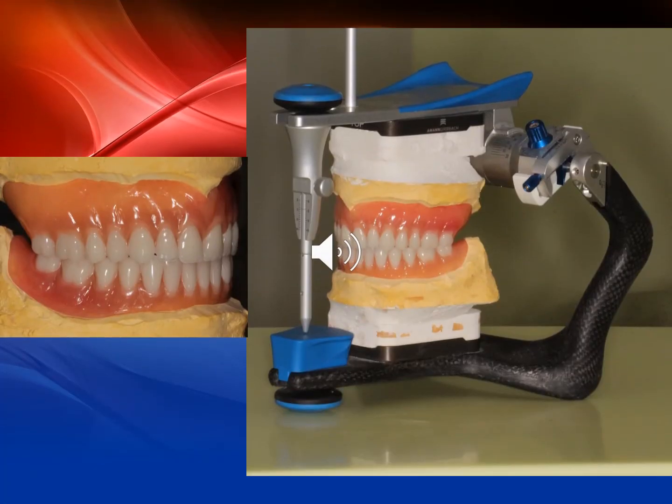Here in this slide, we can see the two dentures related to each other, and they are also related to their respective casts. But also we can see the articulator on the right side. This articulator is where the upper and the lower models were fixed, and this fixation with plaster we call mounting.